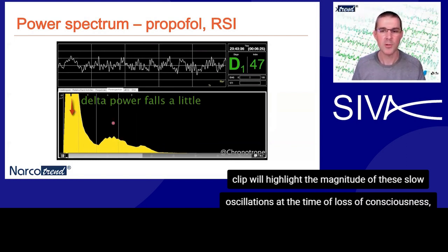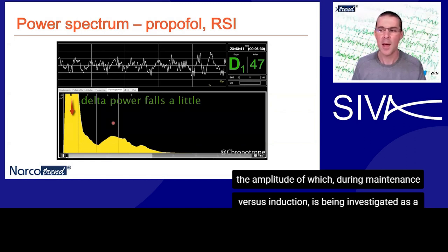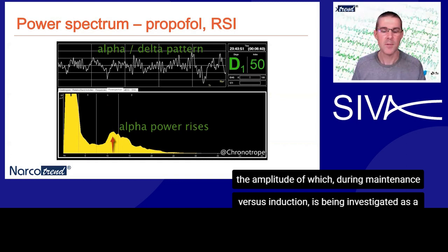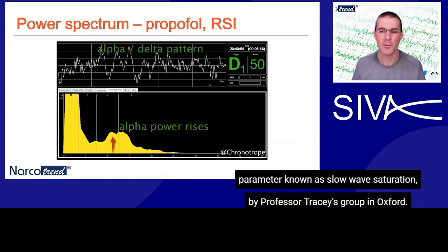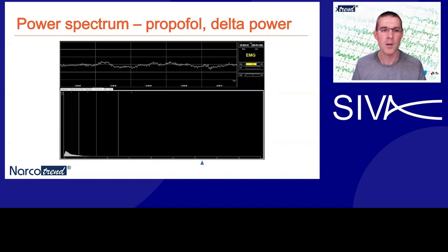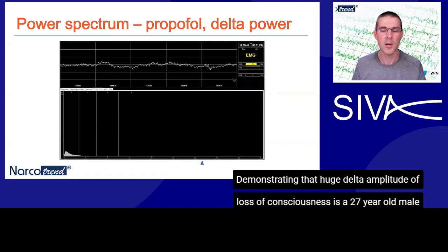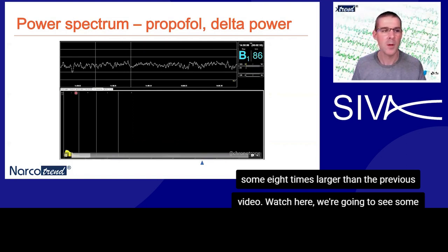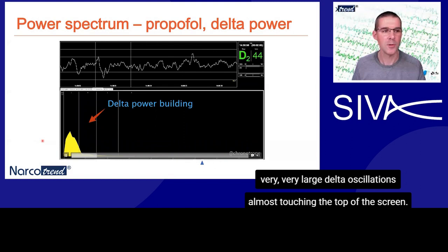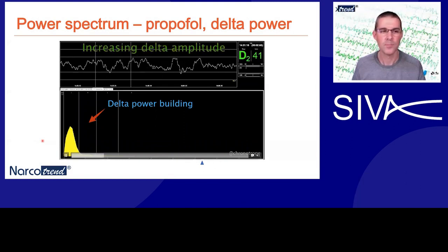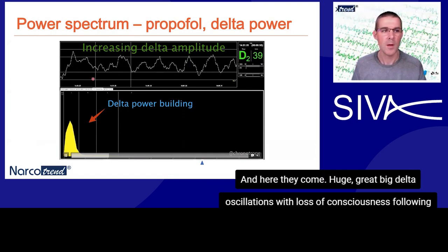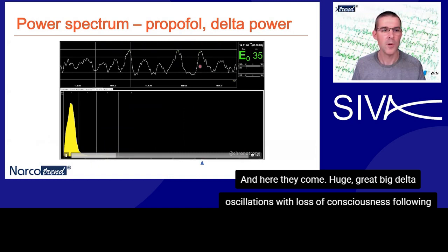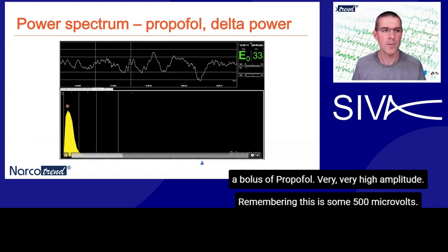The next clip will highlight the magnitude of these slow oscillations at the time of loss of consciousness, the amplitude of which during maintenance versus induction is being investigated as a parameter known as slow wave saturation by Professor Tracy's group in Oxford. Demonstrating that huge delta amplitude at loss of consciousness is a 27-year-old male undergoing a TCI induction. I've chosen a power scale of 500 microvolts for this young brain, some eight times larger than the previous video. We're going to see very large delta oscillations almost touching the top of the screen — and here they come — huge great big delta oscillations with loss of consciousness following a bolus of propofol. Very very high amplitude, remembering this is some 500 microvolts.